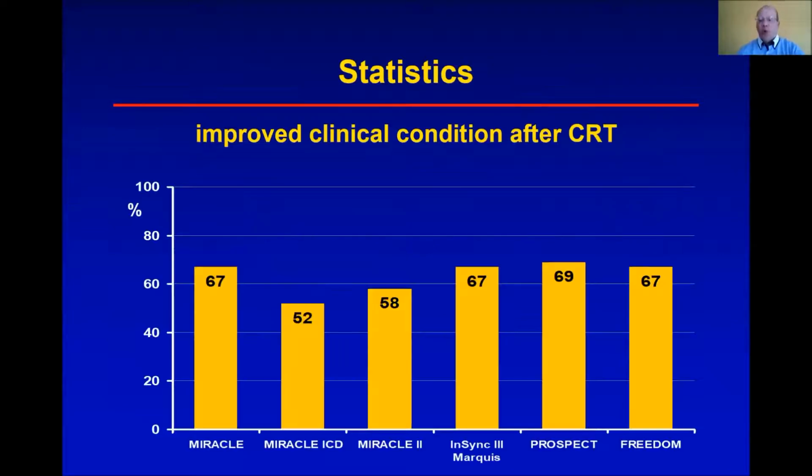The next topic where regional function analysis may be of interest is desynchrony. So we are talking about patients who are potential recipients of cardiac resynchronization therapy. And you know the problem there: despite our ever-changing guidelines, we do not reach a higher success rate than something in the range of 60–70%. So most patients benefit, but there's always a third of patients that doesn't benefit from the therapy. And it's a costly therapy. It takes some effort. It's not without danger during the implantation. So it would be nice if we could select these patients better.